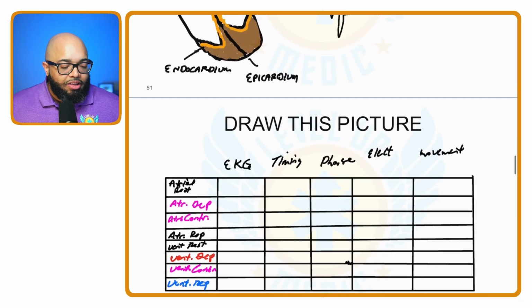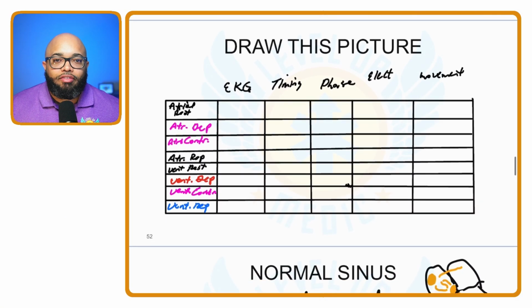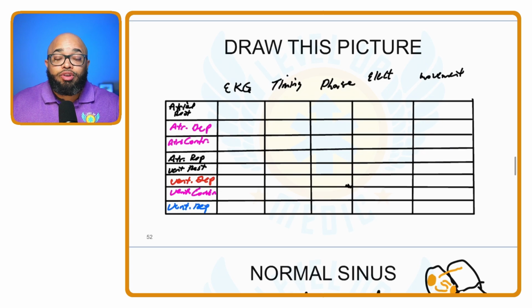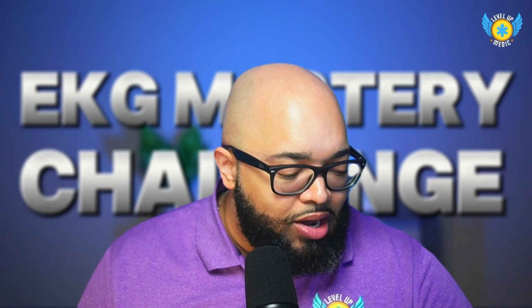So for the 2 top chambers of the heart, the atria, they are at rest, then they depolarize, contract and repolarize, right? And the ventricles are at rest, they depolarize, contract, and repolarize. Okay. So I want to tie all of that in so that you can see everything in one place nicely together. Just watch me do this.